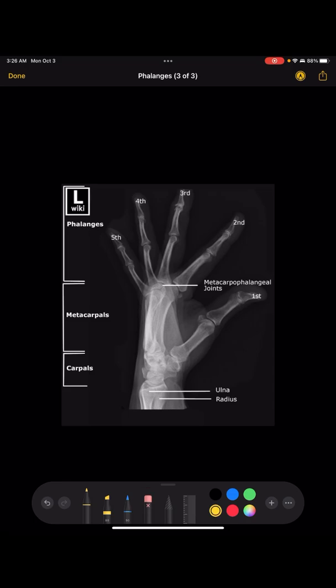For the lateral, you want all of the metacarpals to be as on top of each other as possible, and the ulna and radius to be as superimposed as possible. You want all the fingers to be separated and not overlapping each other. You also really want the joint spaces in the fingers to be nice and open.